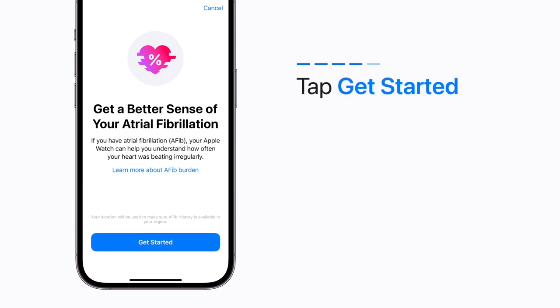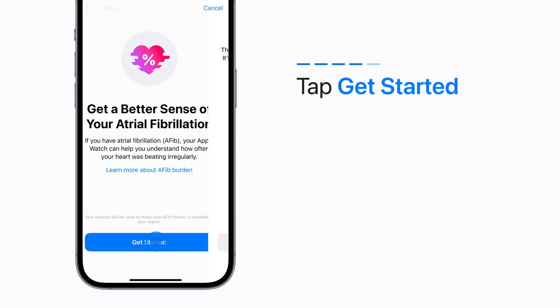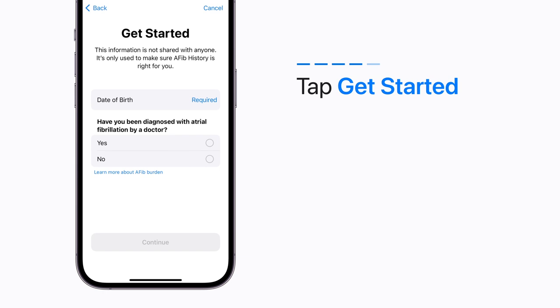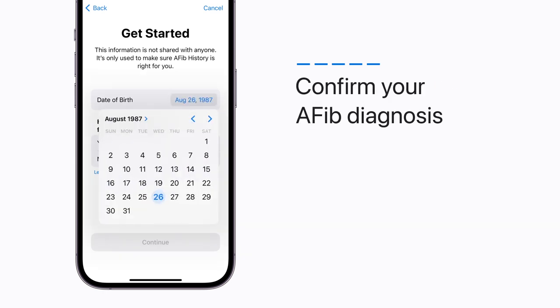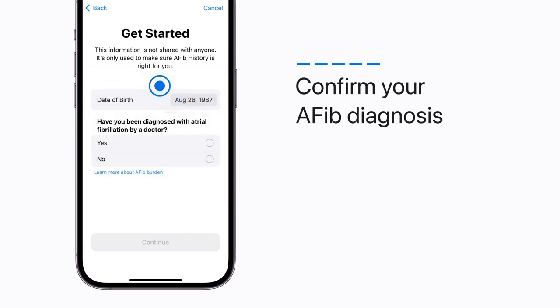Read the brief introduction and tap Get Started. Next, you'll need to enter your birth date and confirm that your doctor has diagnosed you with AFib. Otherwise, this feature isn't for you. Tap Continue.